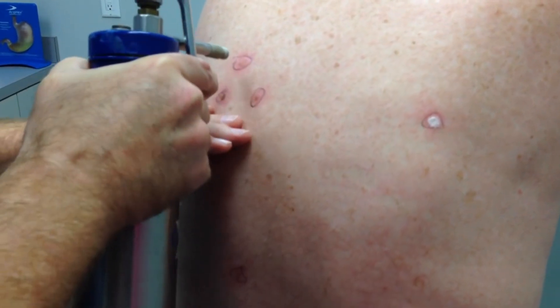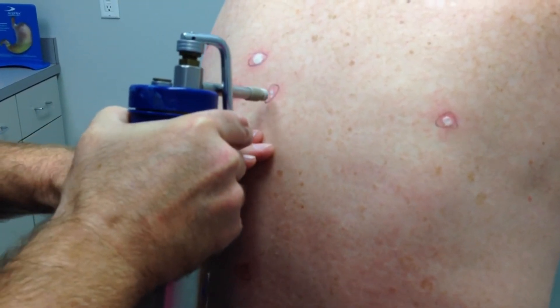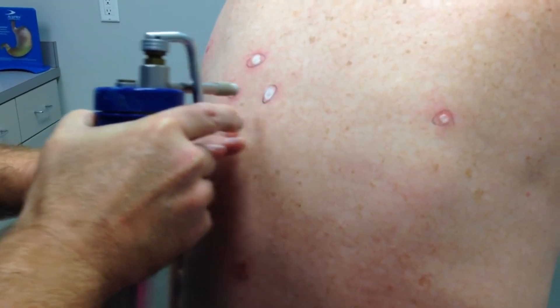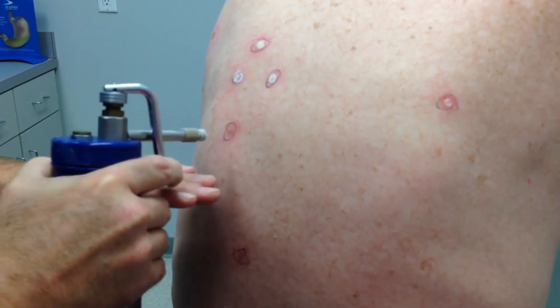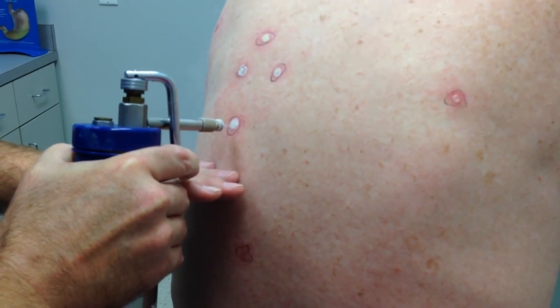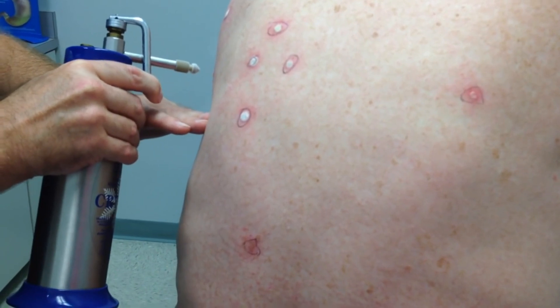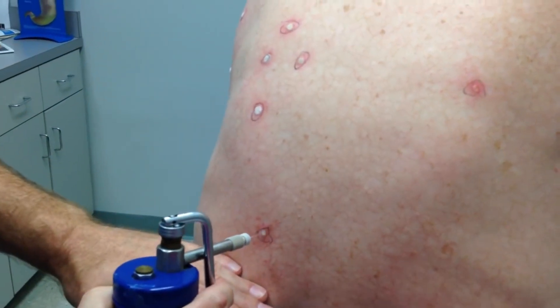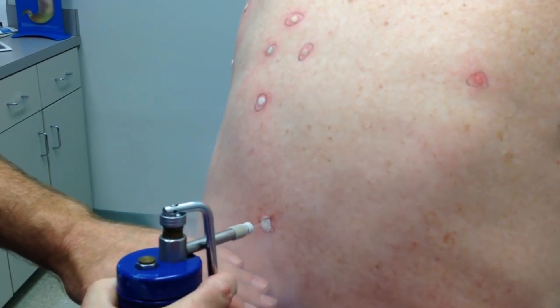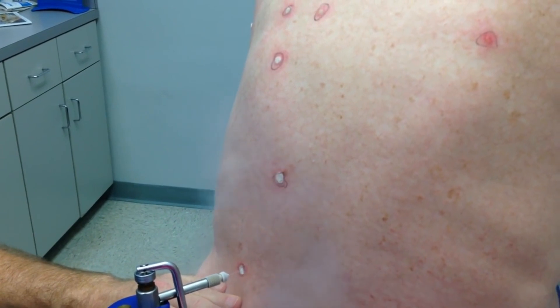Was it more painful? Not able to speak, apparently. We did give it some rawhide, didn't we? Yes, that's more painful — I told you, I'm nothing if not honest. It's burning in the middle but it's kind of cold around the edges, right? Just two more to go... just one more to go. This is the worst one right here. Whoa, that's cold.